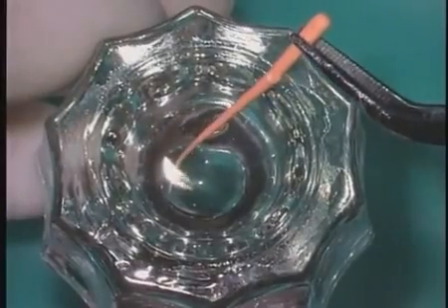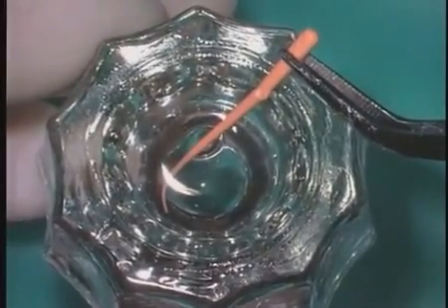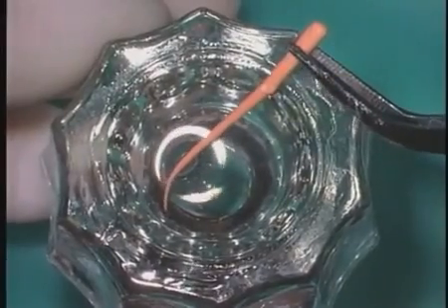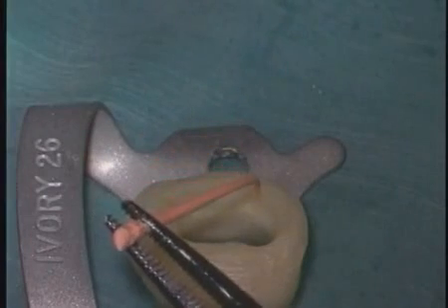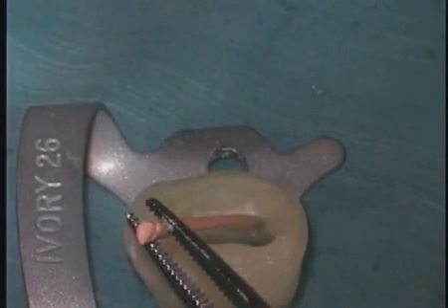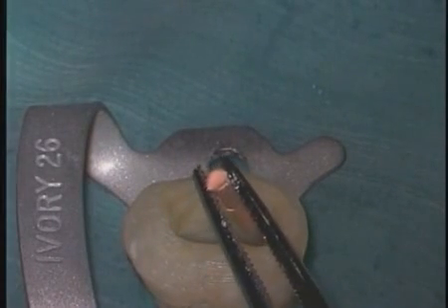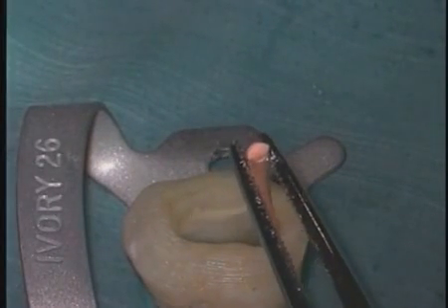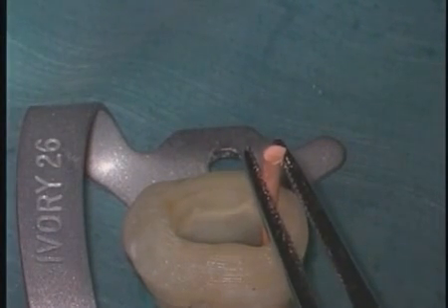To enhance that, let's put the cone in 70% isopropyl alcohol, and this will significantly enhance the rigidity of the cone. Now, when the cone is introduced, we can look at the notch on the master cone, and that will tell us where the cone is apically, and we can then insert it very carefully, bypassing the ledge, so that we can get it to the radiographic terminus.